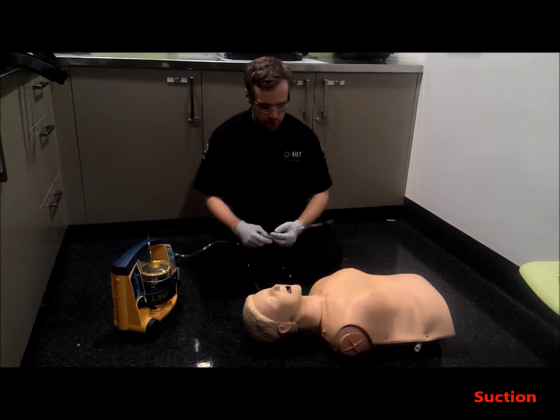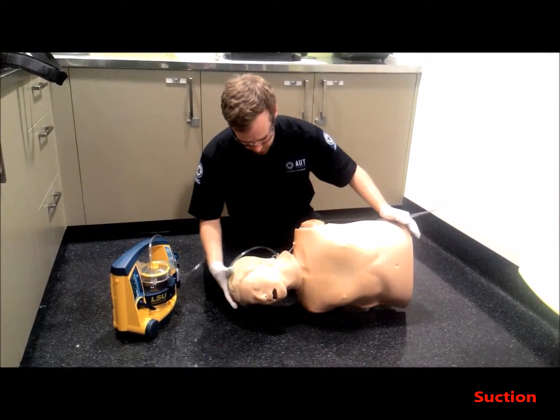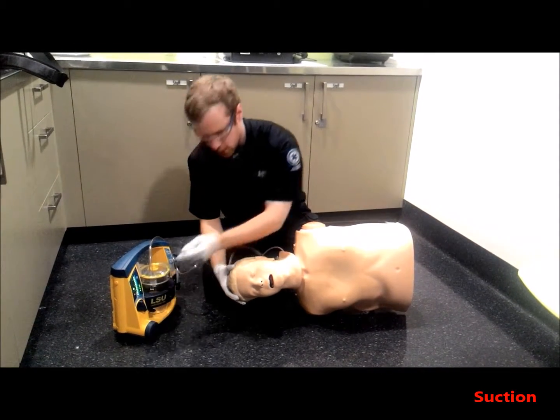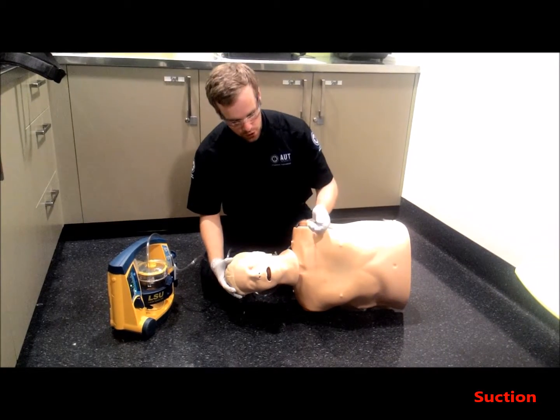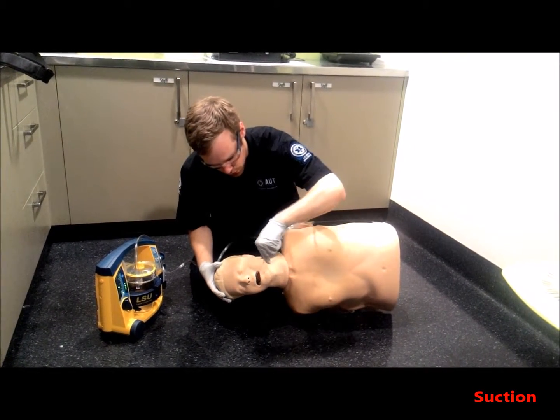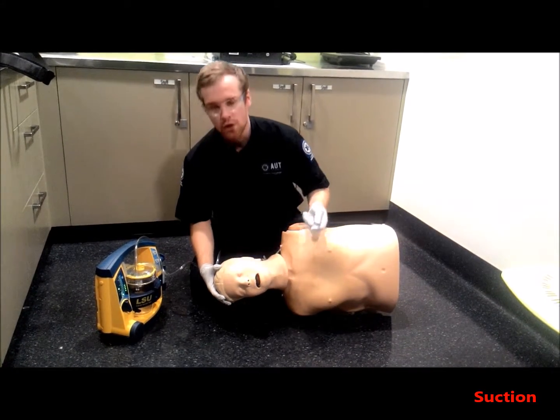When using suction, you want to put the patient in the lateral position on the side, supporting the head. Next, you want to turn on the suction and close circuit suction in his mouth, just as far as you can see. Small circular motions, only sucking on the way out for no longer than 10 seconds.